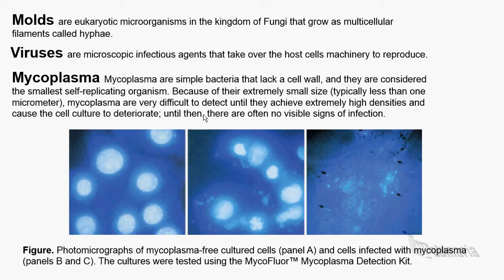Under microscopy, the mycelia usually appear as thin filaments and sometimes as denser clumps of spores. So for example, in this picture you can see molds. I couldn't put a picture. Anyways, they are pretty similar to yeast.